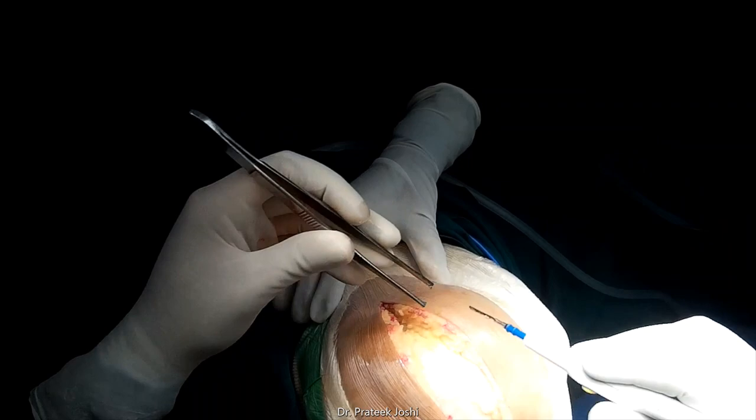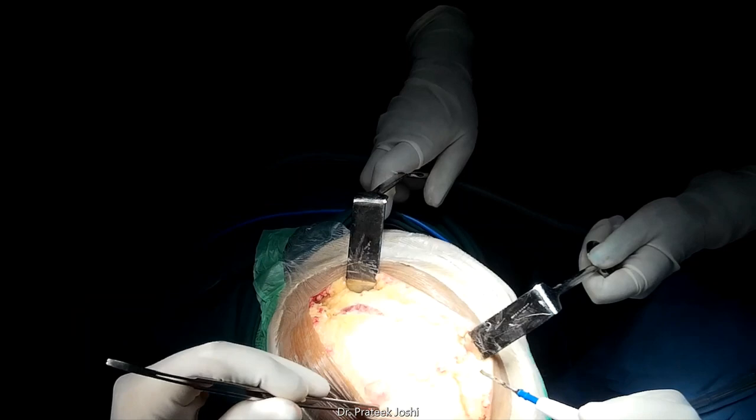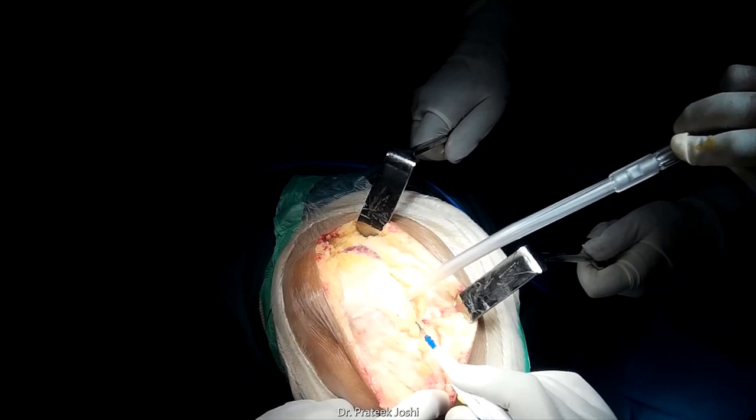Then we identify vastus medialis, rectus femoris and patellar tendon because they are the landmarks for our medial parapatellar arthrotomy. Following the identification, medial parapatellar arthrotomy is completed and patella is everted.